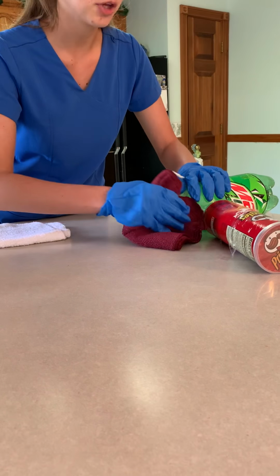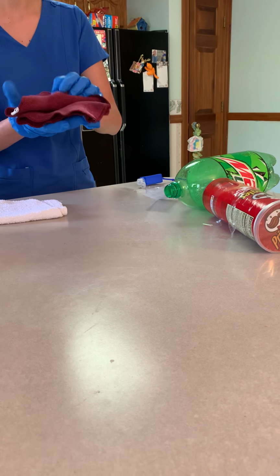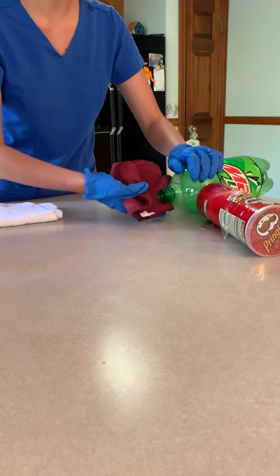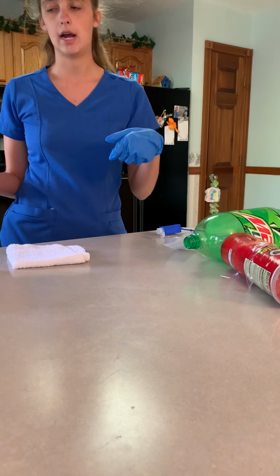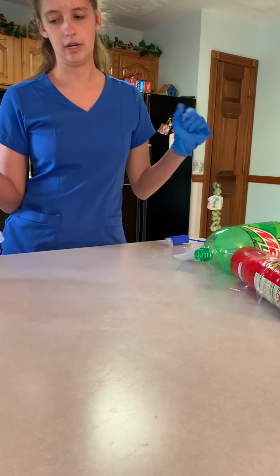We're going to go around the shaft of the penis with a different part of our rag in a circular motion. Then we're going to go up and around the scrotum in a circular motion with a different part of the rag. Next, we would pat dry the patient if they needed it.